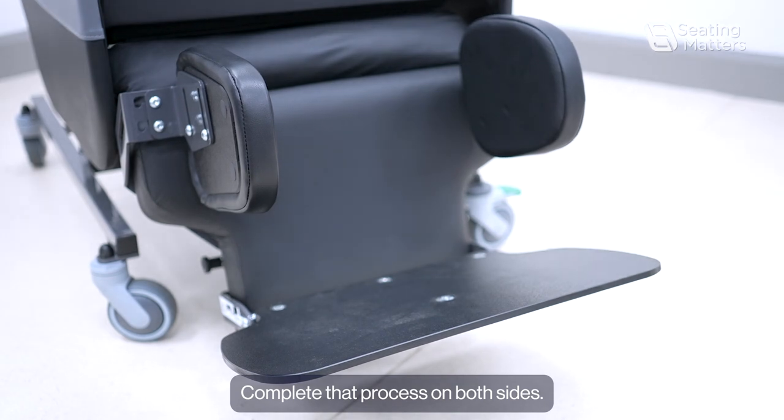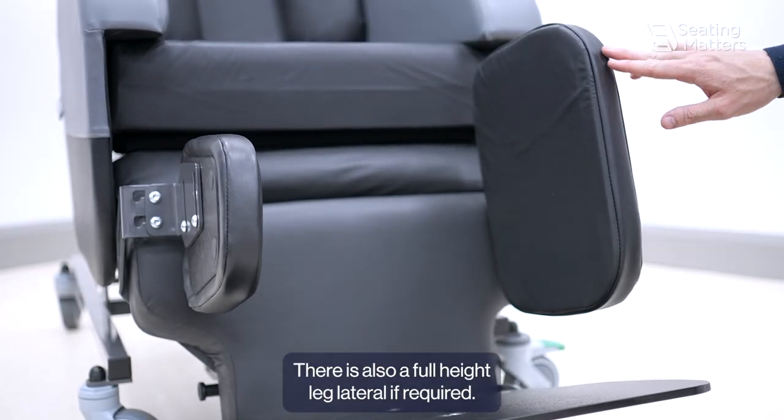Complete that process on both sides. There is also a full height leg lateral available if required.